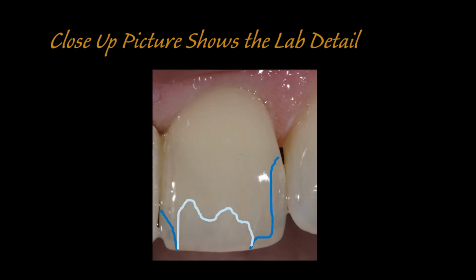This next photo you'll see kind of the same thing. Look at the mesial and distal interproximals. You'll see kind of that bluish translucency. To me as a ceramist, in the porcelain that I use, I see a double E9, which is a particular porcelain that gives me that effect. Now I can choose that only because I see that. Now dead center, you kind of see that area highlighted. It kind of has more of a bluish opal effect. Well, that's an opal porcelain, so I would pick opal porcelain. So you see the detail that this starts to give us.